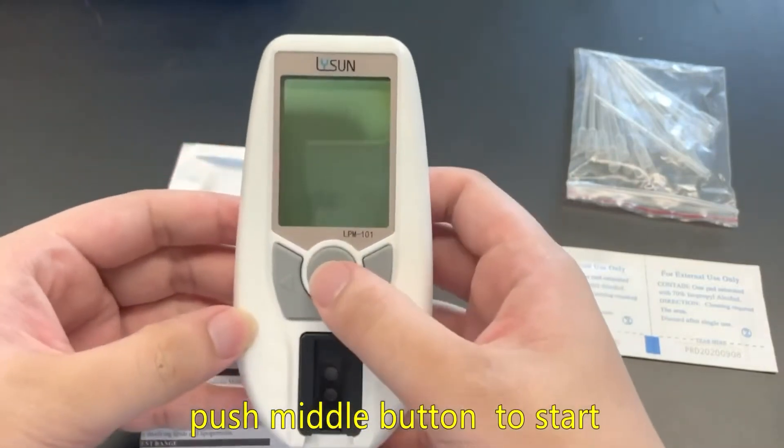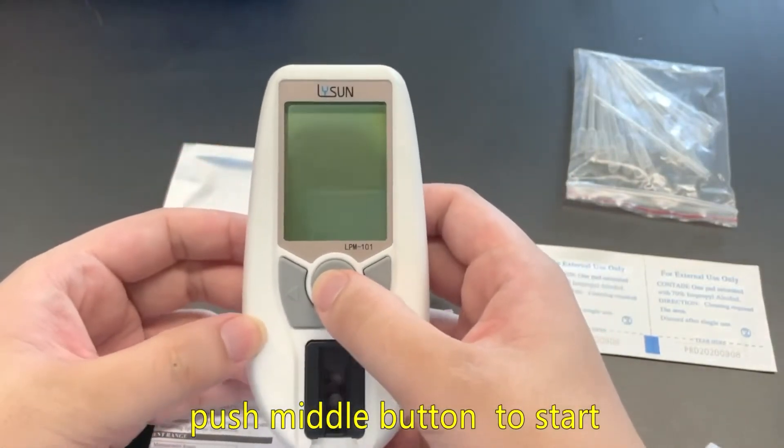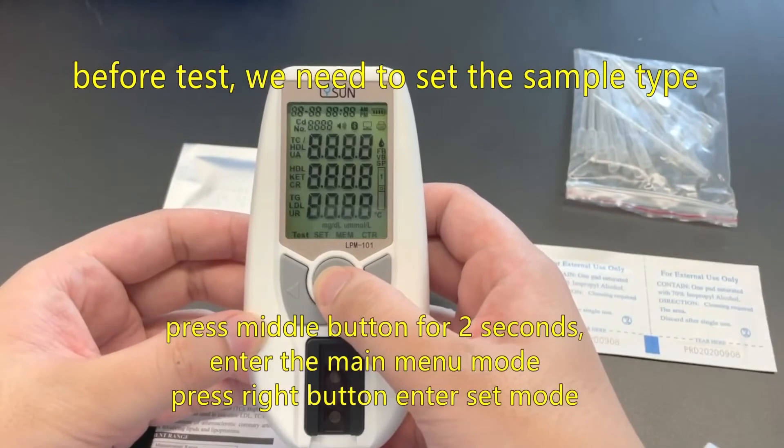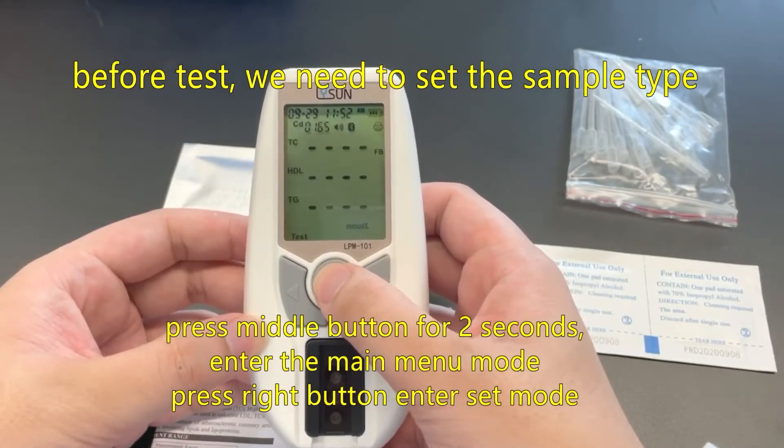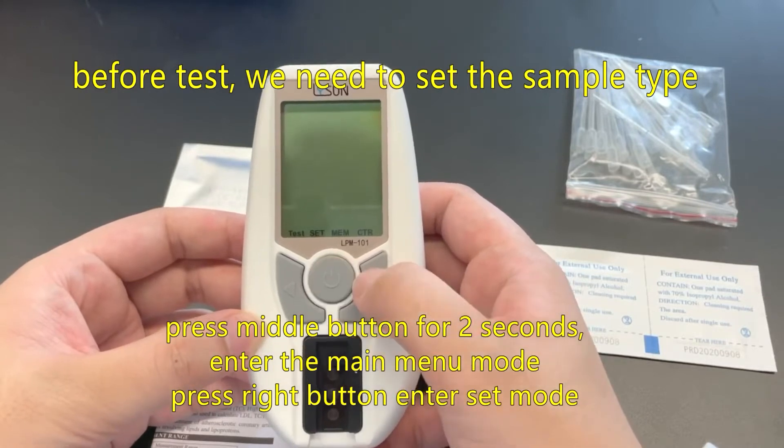Push middle button to start. Before the test, we need to set the sample type. Press middle button for two seconds to enter the main menu mode, then press right button to enter set mode.